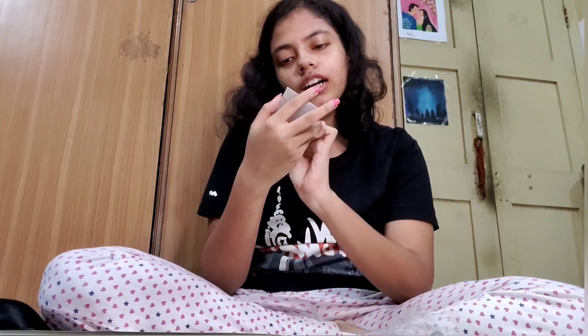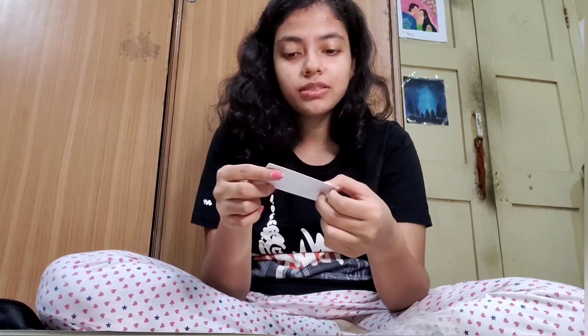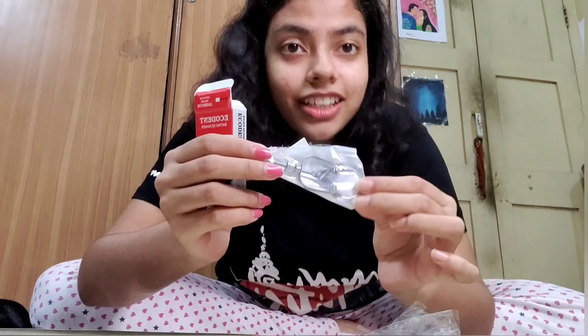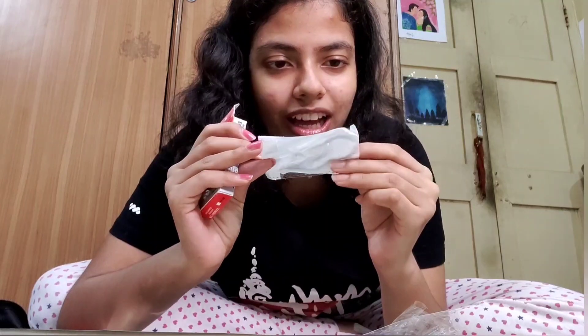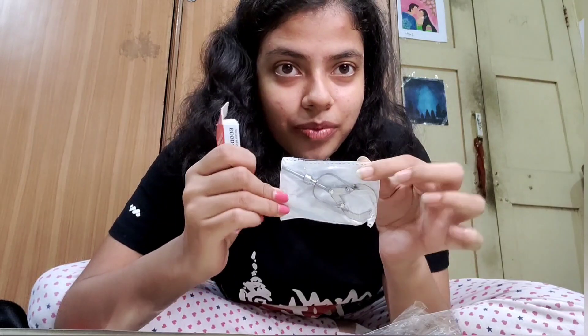Then we have something called the Ivory's pattern — I won't open the seal right now because it's tightly sealed. This is Ivory's pattern. We also have a matrix retainer. I think I can open this one because it's not sealed. Oh, that's interesting — oh my god, how beautiful is that! I love it. So this is a matrix retainer.